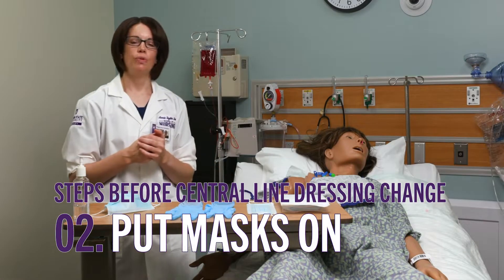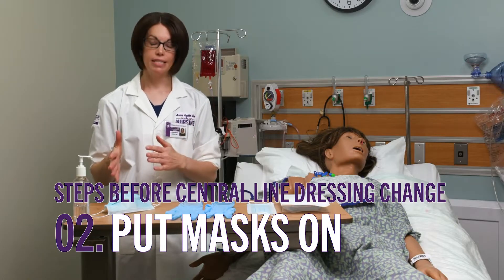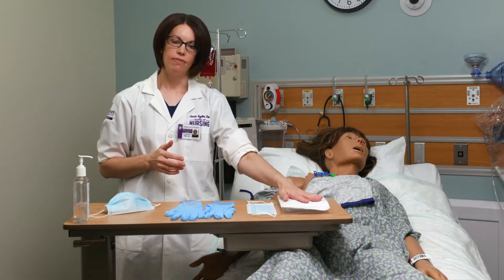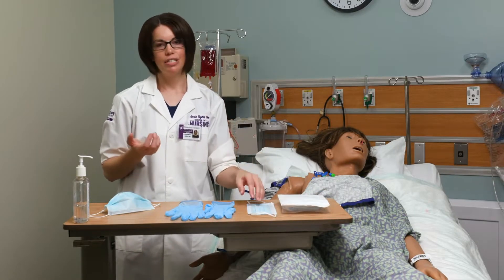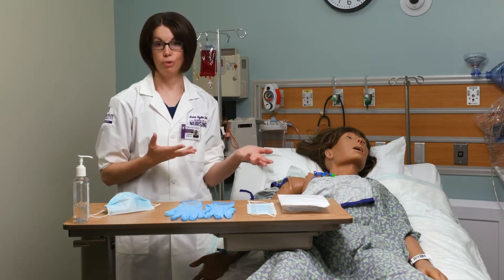The next thing I want to do is make sure that I am putting a mask on myself and also putting a mask on the patient. There is a mask inside of the dressing change kit, but it's a little harder to access, so it's easier to have one already on you and already on the patient before starting the procedure.